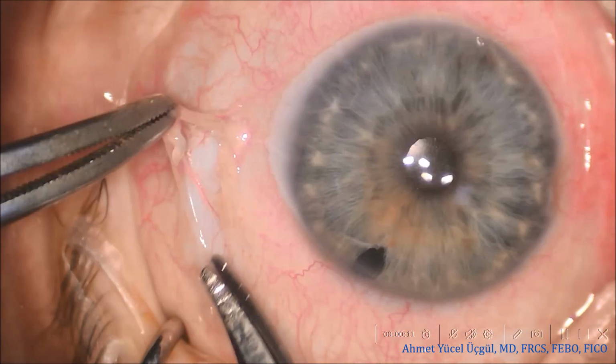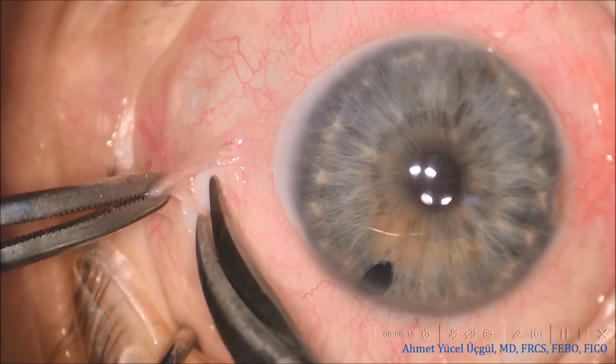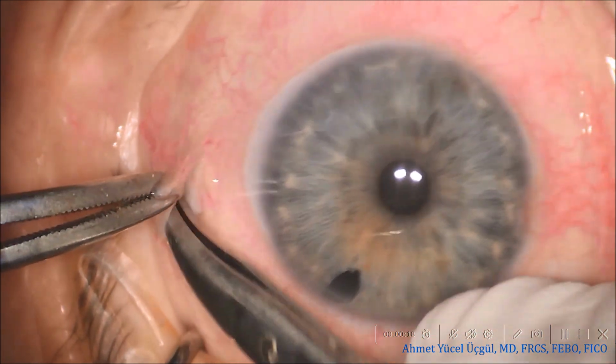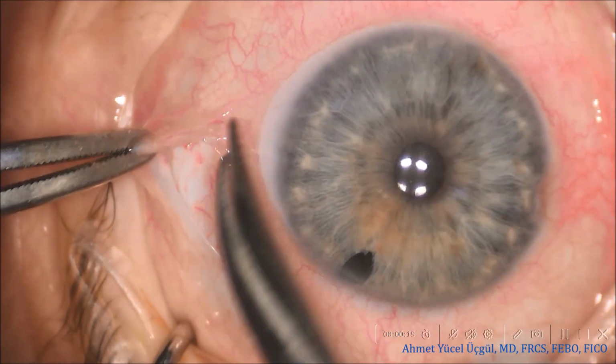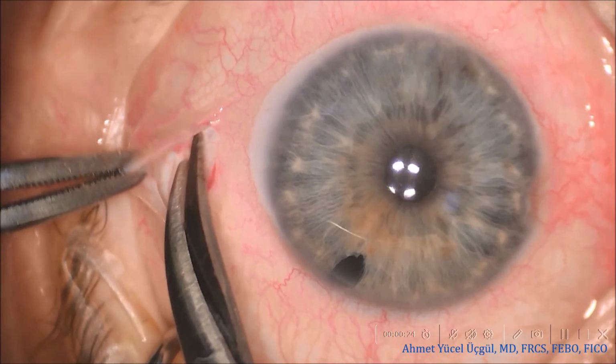At this stage, the superotemporal conjunctiva and Tenon's capsule are carefully dissected using Westcott scissors until the bare scleral surface is fully exposed. This step provides adequate surgical access and allows proper preparation of the implantation site.